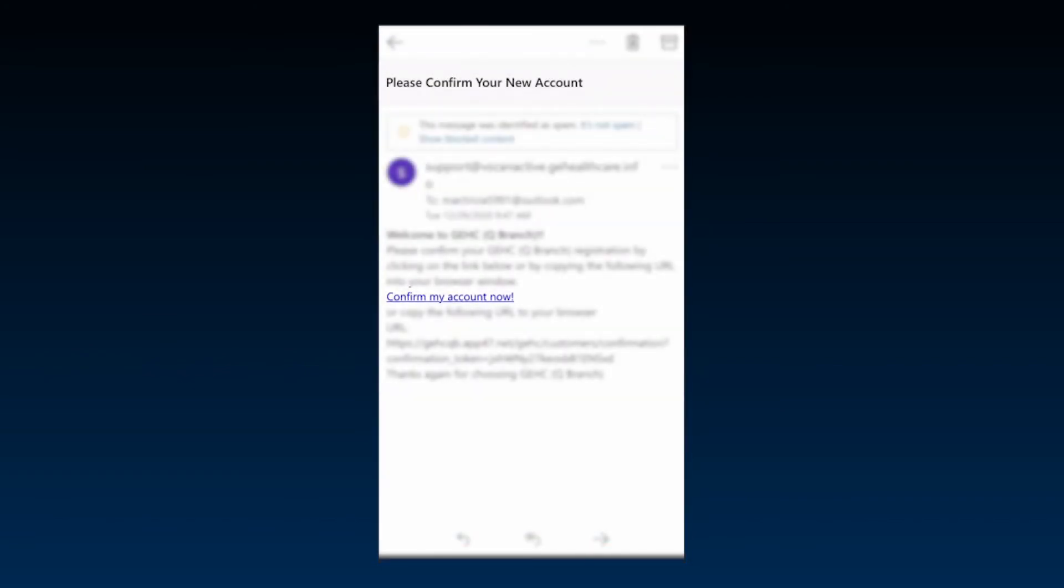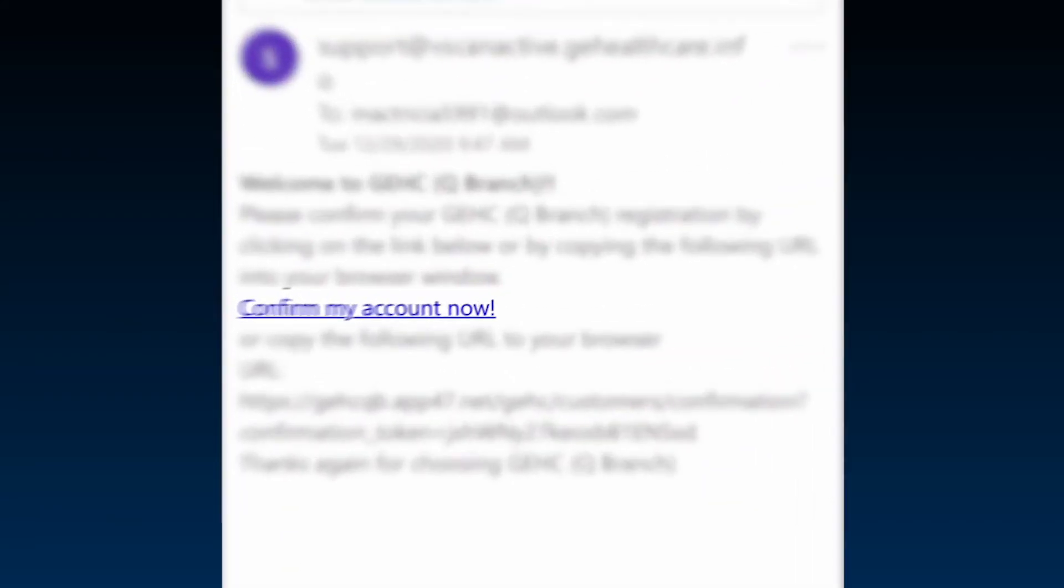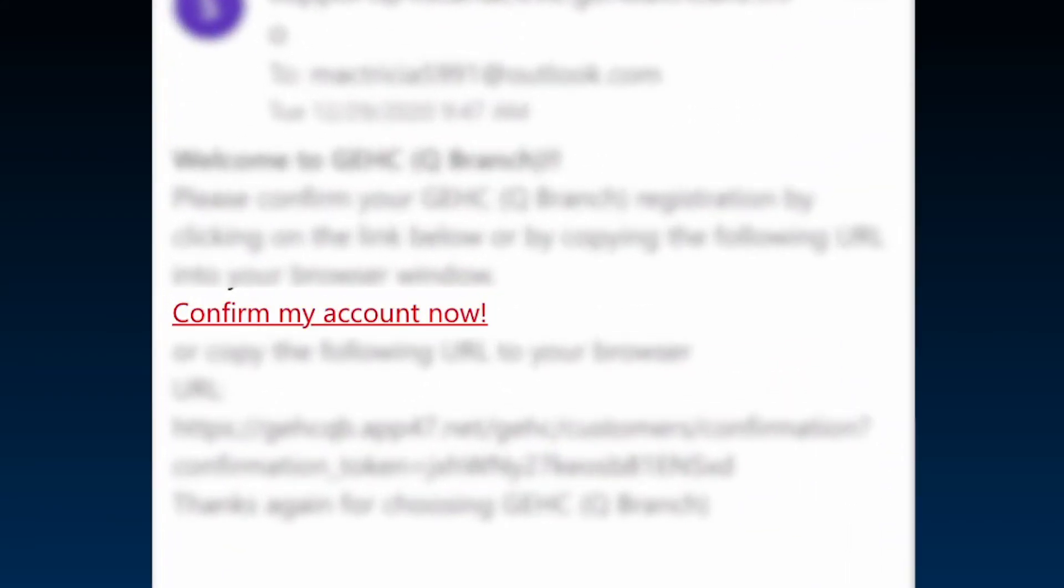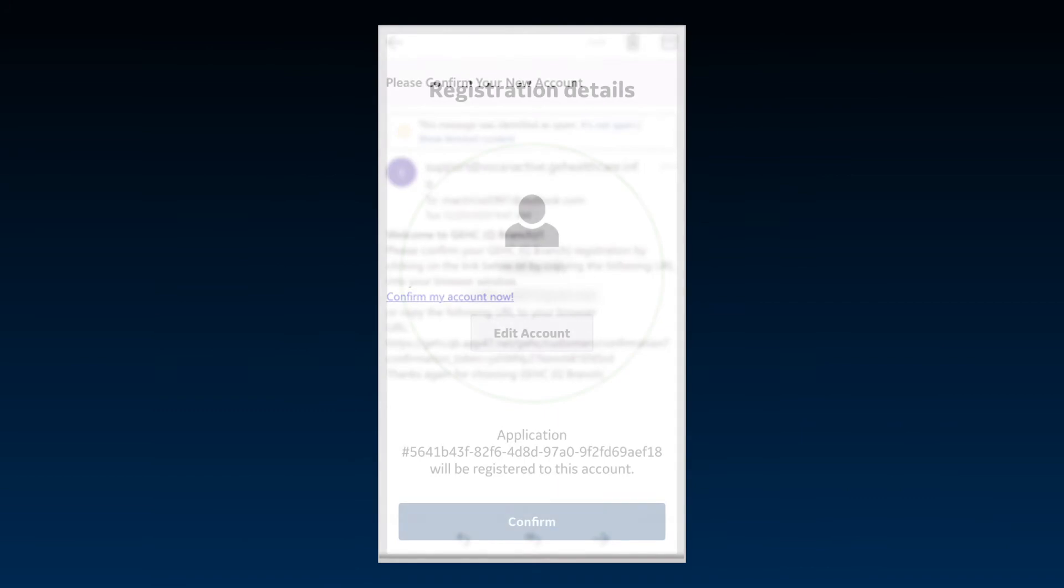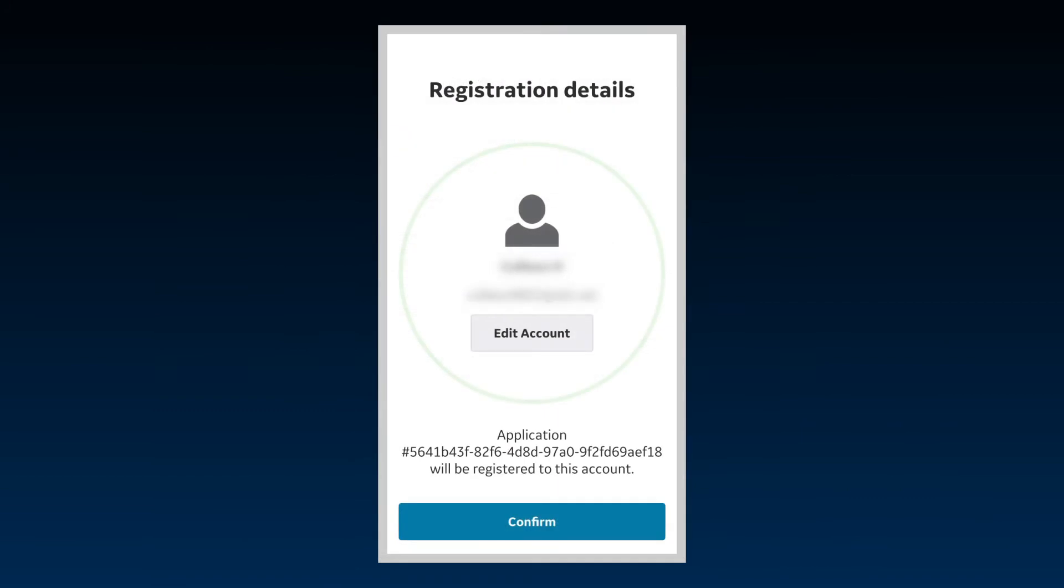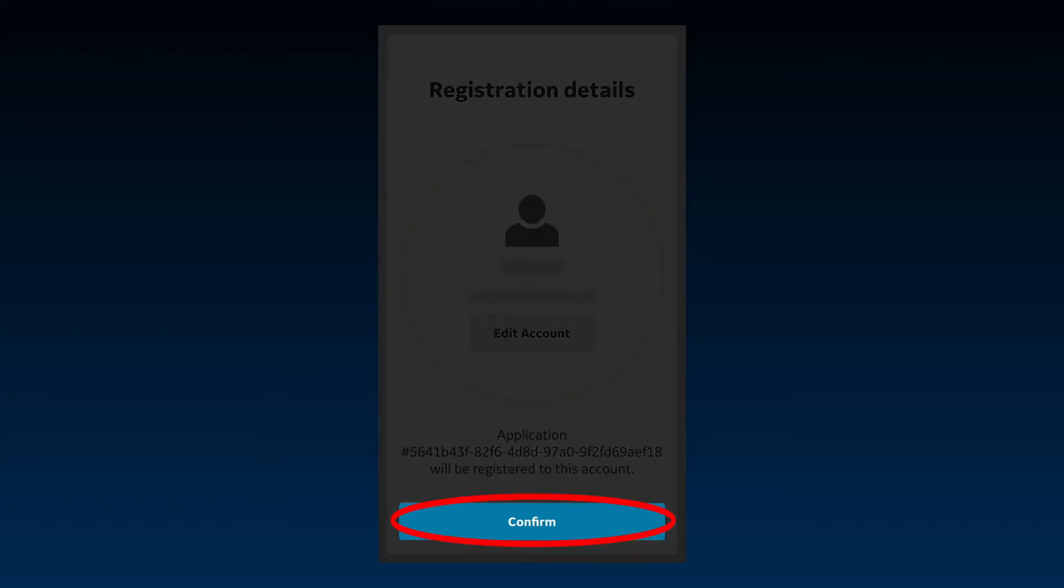To validate your account, an email will be sent to the email address that has been provided. Click on the link in the email to confirm your account details. Once the email is validated, the app screen will now be updated with your registration details. Press Confirm to complete the registration process.